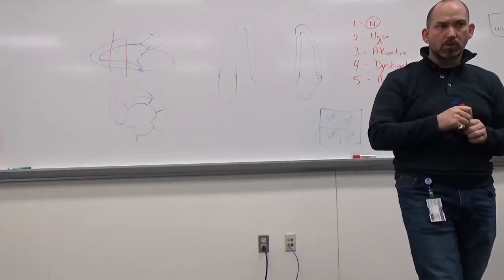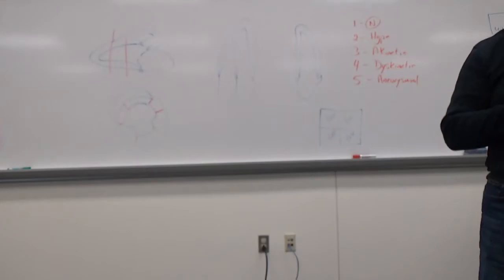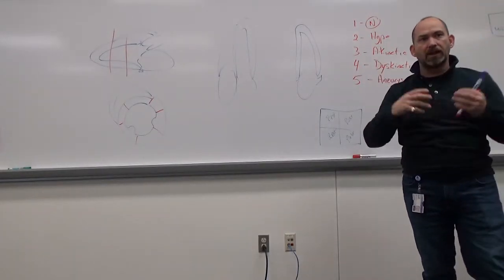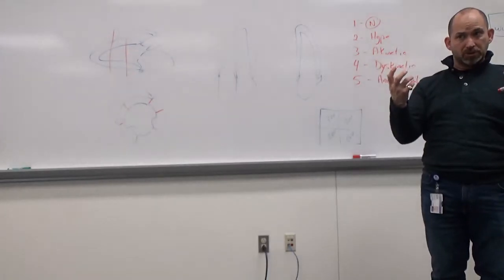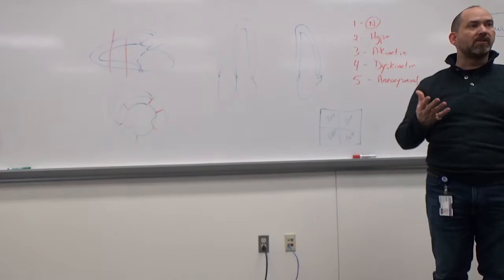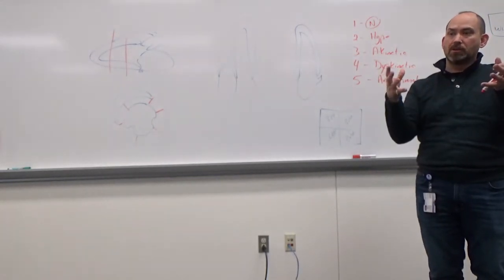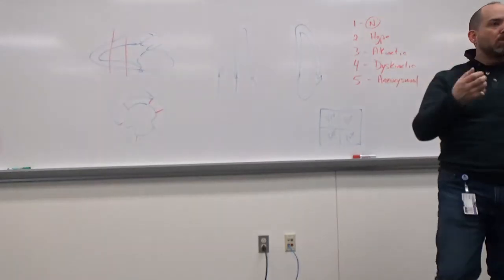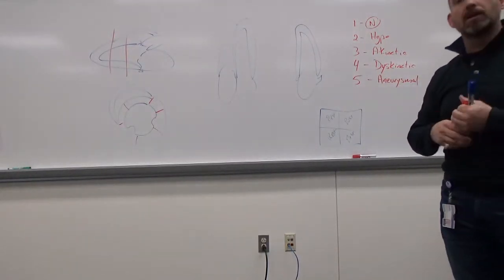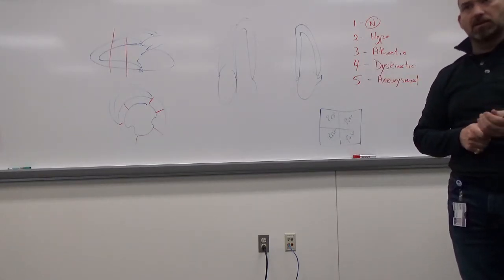Why does it only go through the right heart? Because the bubbles get popped in the lungs. And it doesn't affect the lungs in any major way. Now, if I let a big bubble accumulate in there, then it could be bad. Or if I've got very slow flow in the veins, that could cause air to congregate together. And what happens when bubbles congregate together? They get bigger. So we do have to be careful of that, and make sure the physiological state of the patient is able to handle that. And so that's the agitated saline.